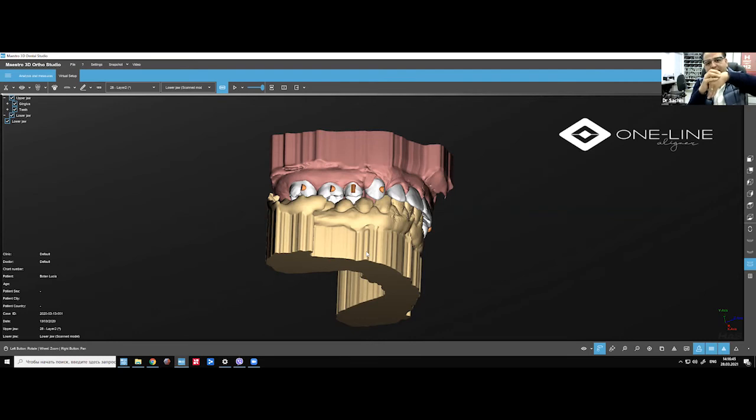So it can also help us for extrusion without any attachments, if you make the movement slower. Or after you have done the aligner, if you have it beyond the gums, you can make points of retention with the pliers. So you can do extrusive movements with the aligner without any attachment.